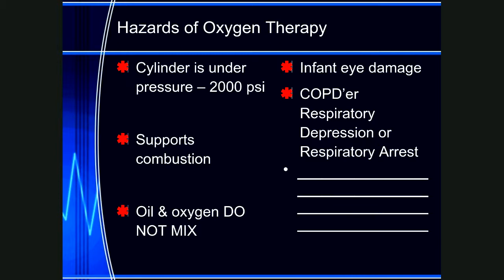Remember, cylinders are under pressure at 2,000 psi. Oxygen supports combustion. Oil and oxygen don't mix.